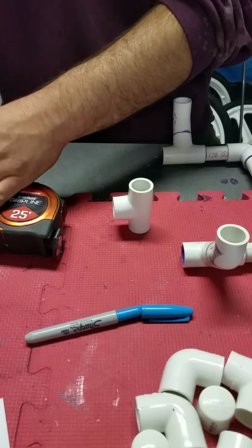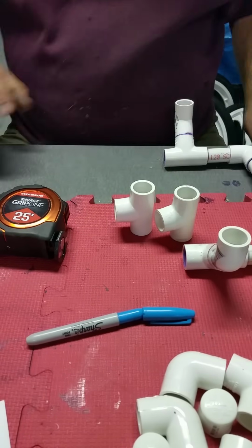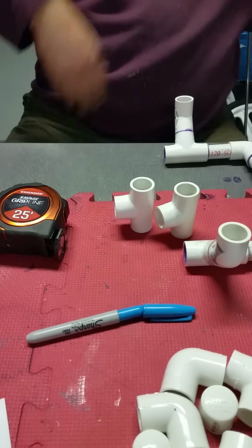So we're getting ready to attach the part of the arm that's going to attach to the belly support bar.